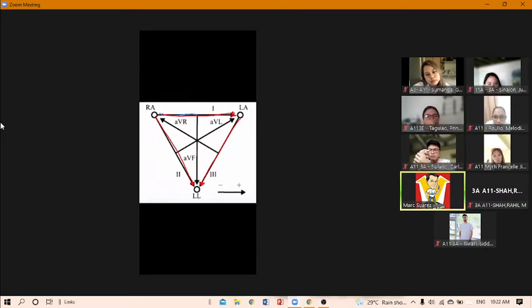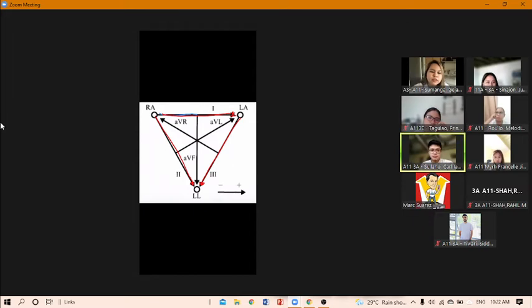So what does that tell us? Opposite of the arrowhead is the negative electrode, and where the arrowhead is, that's the positive side. Since this is bipolar, there's a negative and there's a positive. Everyone follows? Yes, Doc.